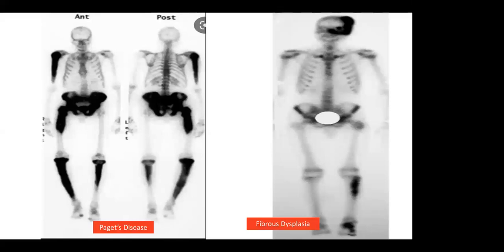Next, a bone scan is also a good modality to assess for primary metabolic bone disorders. For example, Paget's disease. The image on your left-hand side shows typical features of Paget's disease on a bone scan, where there is multiple bone involvement. The bone is expanded, with very diffuse uptake of tracer. Another example I can give is fibrous dysplasia. In this patient, there is very intense uptake around the skull and the sphenoid bone, a parrot wing sign, and also involvement of bone in the left lower limb. So you could use it to assess metabolic bone disorders. And if therapy has already been initiated, you can do a follow-up scan to see whether it is responding or not.